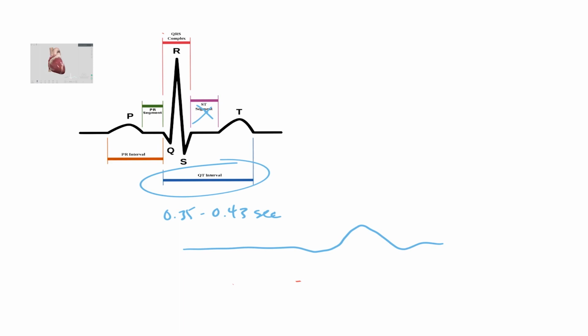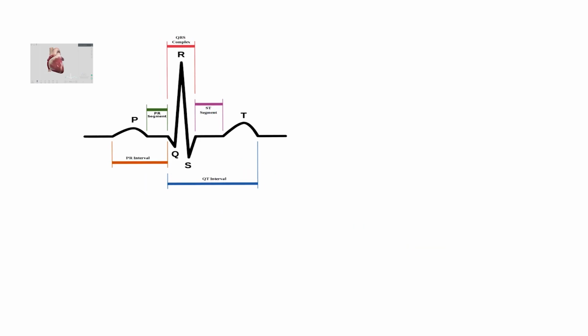Okay, so let's go on to the EKG changes caused by electrolyte abnormalities.